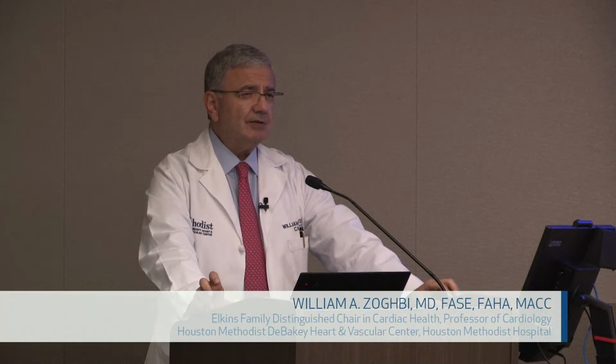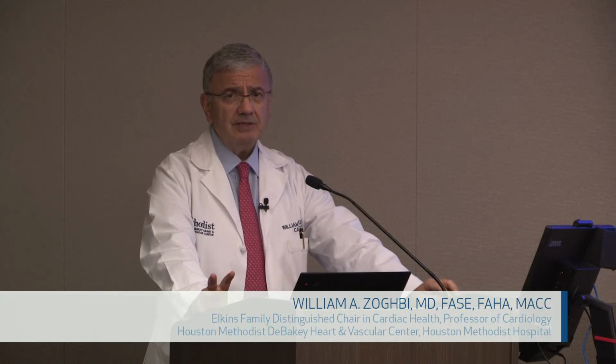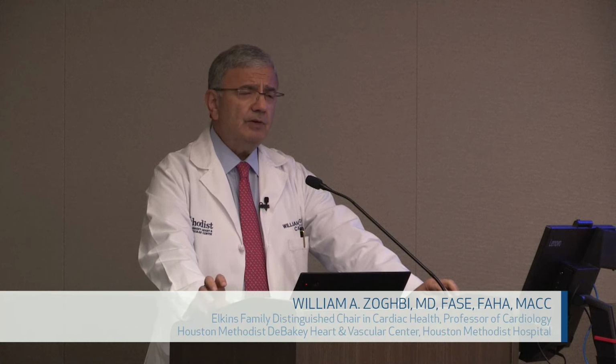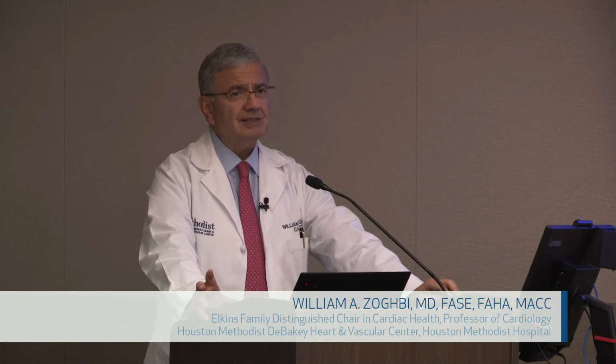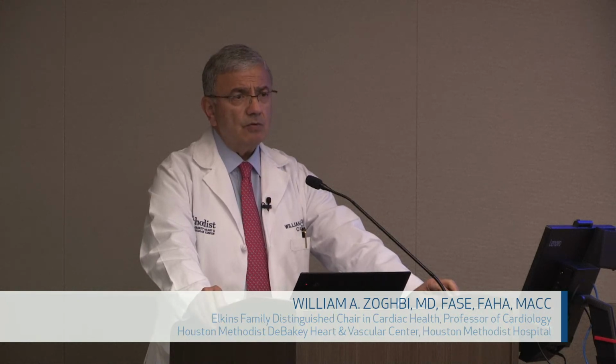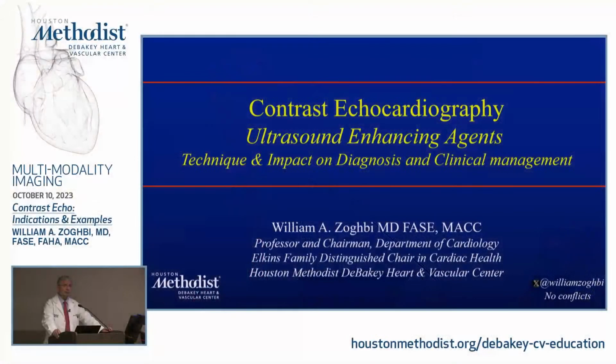And the reason for it, we talked about it before, is that contrast echocardiography, or using ultrasound enhancing agents, even with agitated saline, not only gives you some diagnostic information, but also interacts with your machine settings. So you need to understand the machine settings. How does it interact with ultrasound so that you get the diagnostic modality and diagnostic impact that you want, otherwise you will be disappointed.